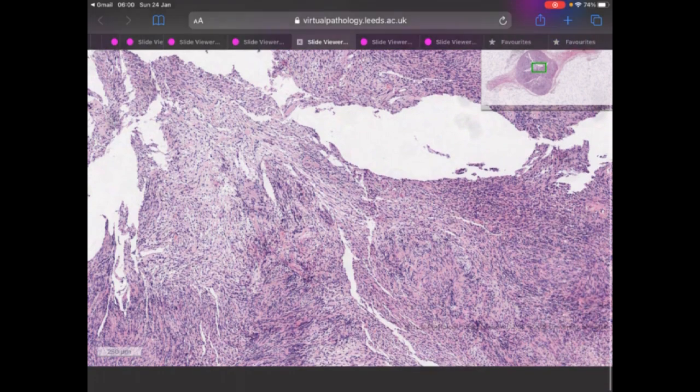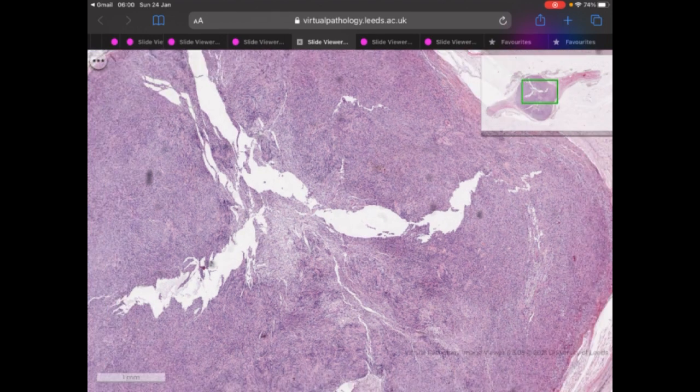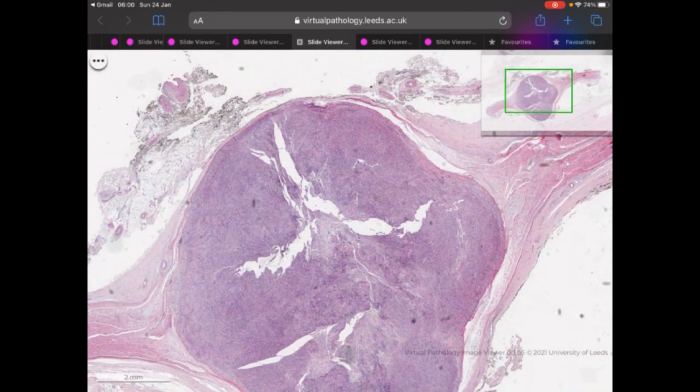Okay, I think that's all for my video, for my practical of the CNS tumors. I hope that this video will give you benefit and a better understanding of the gross and histologic features of the common CNS tumors. Many of the pictures are taken from internet sources and also books, including pathology books, and visual slides from a website, the University of Leeds. So I would like to thank and acknowledge them for all the content in my video.